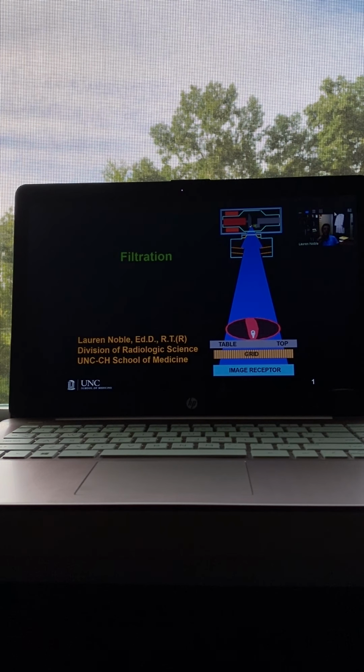But do y'all remember the specific spot on the anode that it will hit? What is that area called? The actual focal spot. Exactly. And then the area from which those X-rays will diverge out, because the electrons hit the actual focal spot, and then they diverge out from the face of that anode. What do we call that area? Effective focal spot. Yeah, great. Effective focal spot. Exactly.